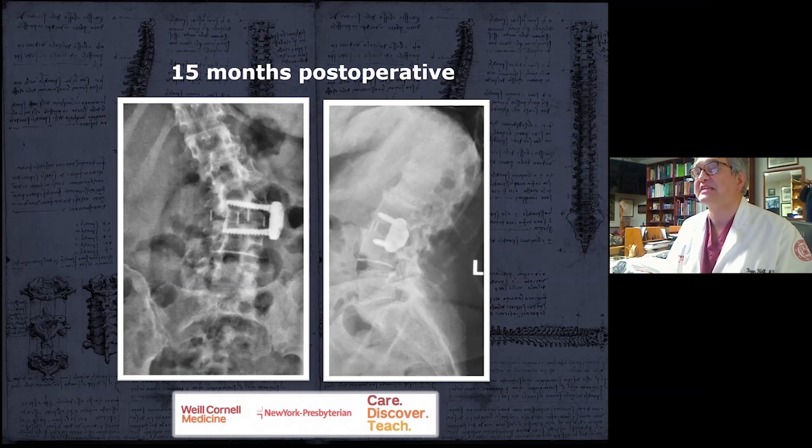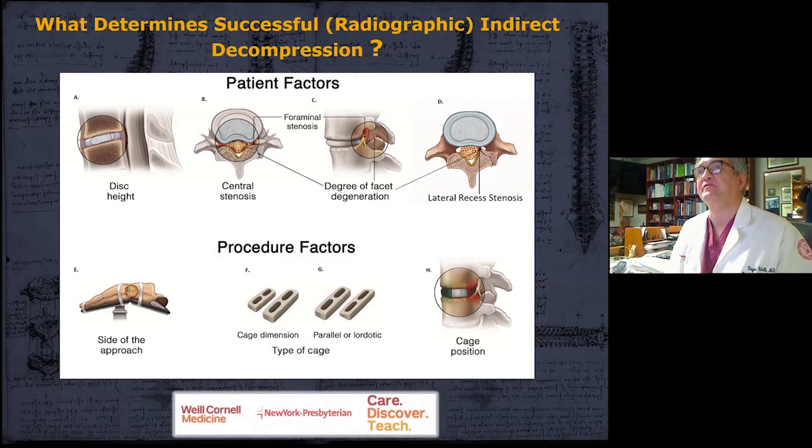I don't do this anymore now with these lateral plates. Biomechanically, they're not very stable. I will always put in pedicle screws now, and you can do that in a single stage operation with navigation or without navigation. But in this case, this is a few years ago. This worked out very well for this patient, and she went home pain-free.